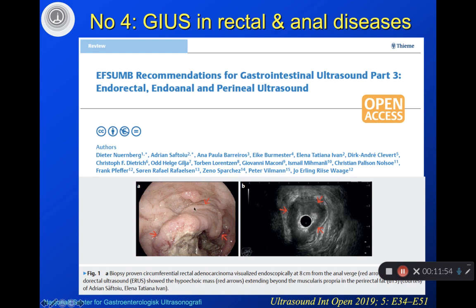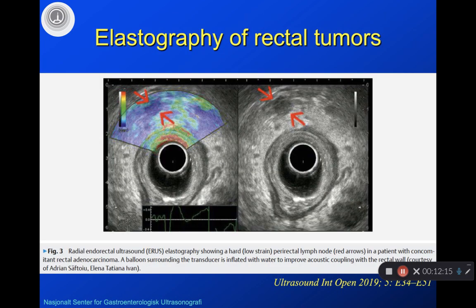You know, there is a great limitation with endoscopy, being able to view only the surface, but using ultrasound you can see right through the wall how the tumor is involving surrounding tissue, and you can do a much better stratification and give advice regarding prognosis using this method.